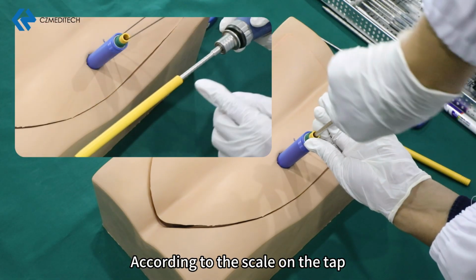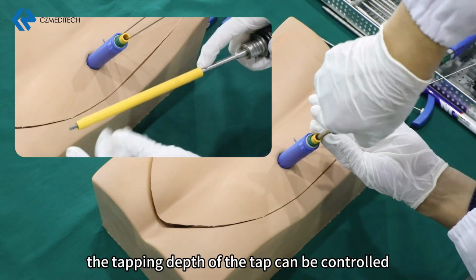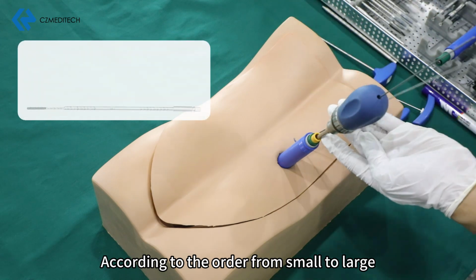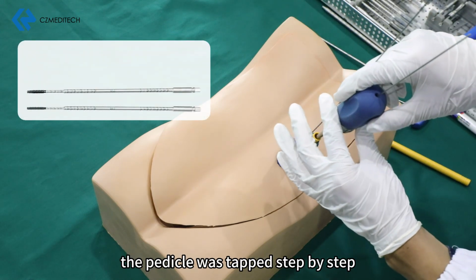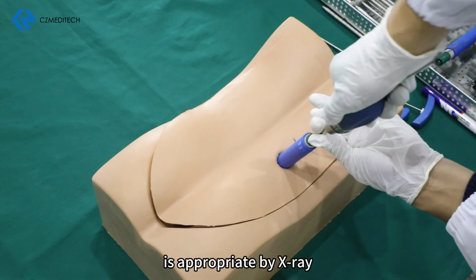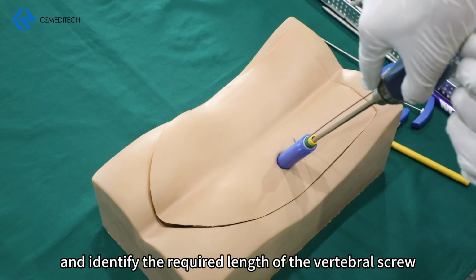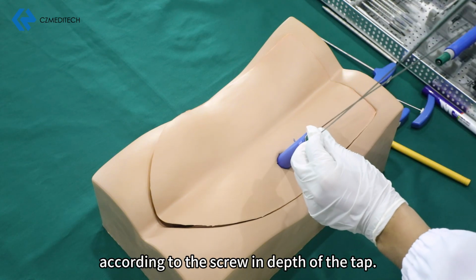According to the scale on the tap and combined with the secondary sleeve, the tapping depth of the tap can be controlled. According to the order from small to large, the pedicle was tapped step by step. Determine whether the screw-in depth of the tap is appropriate by X-ray, and identify the required length of the vertebral screw according to the screw-in depth of the tap.